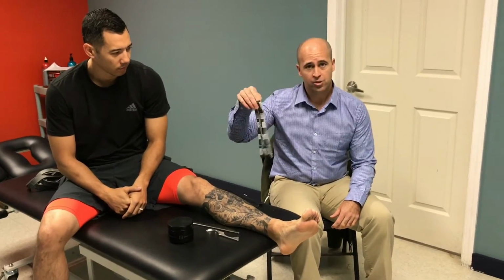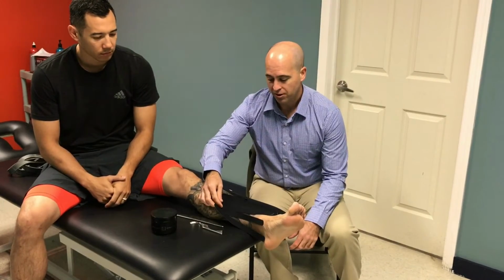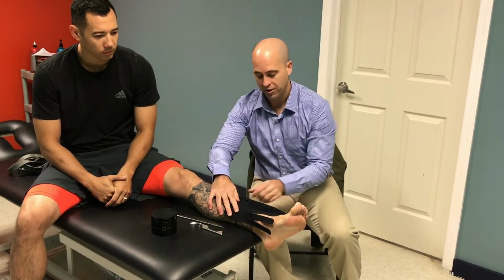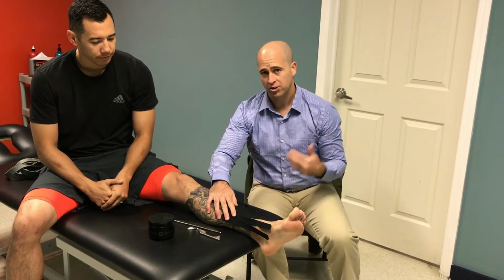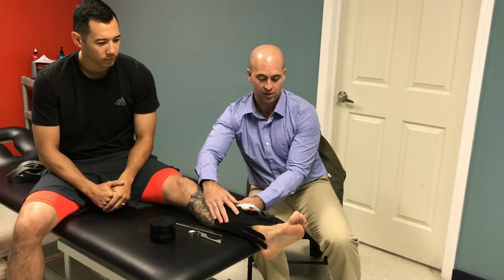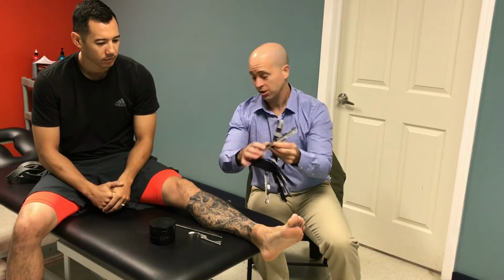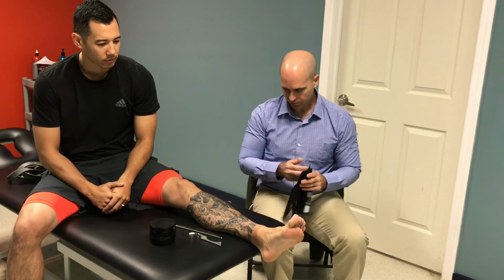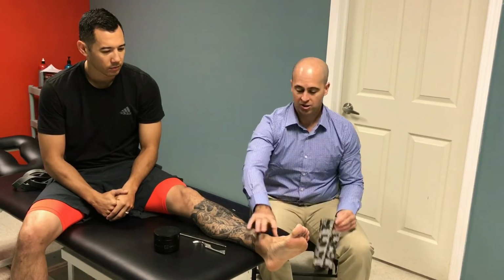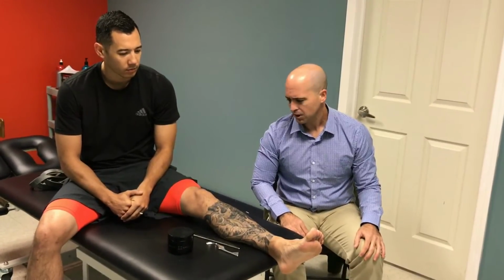And we used some taping methods where we put this up on his shin, and then we used all these little fingers, spreading them out around the swelling to lift the skin, promote circulation, and help with that swelling. We went like a basket weave pattern where we put two of these, and then we wove these across each other, and it's pretty effective. The second visit he came in, you could actually see the little fingers over the swelling where it had helped. Actually not too bad of bruising for how bad of an injury it was.